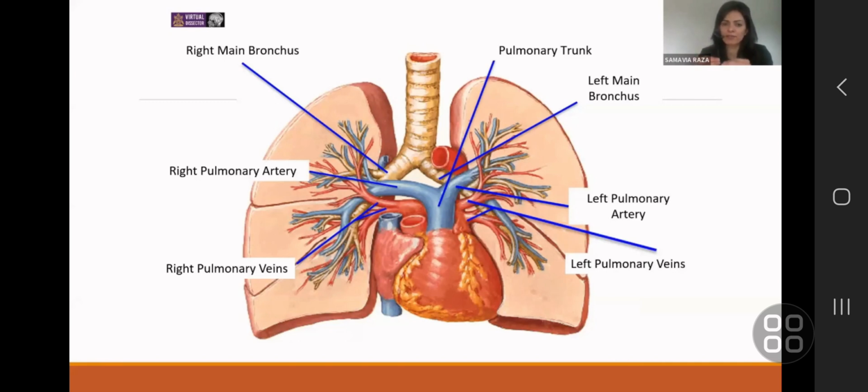If the right bronchus is higher than the artery, does it matter to you on CT? It doesn't, because you can see what's around it. If what is around it and what is in the wall of it is normal, it doesn't matter if it's on the top or the bottom or the left or the right, because there is all sorts of normal variation in the human body.